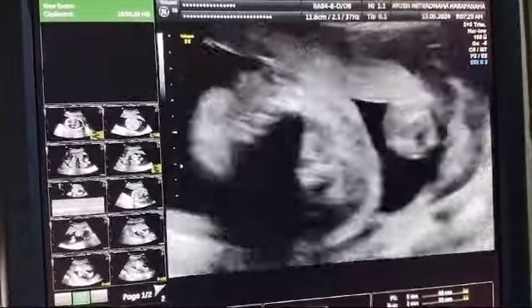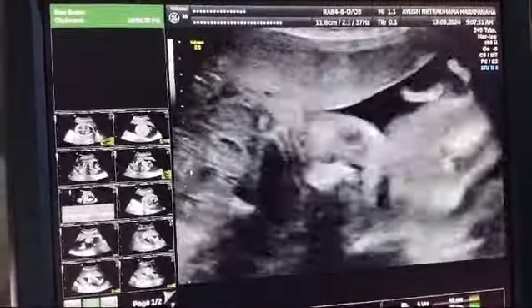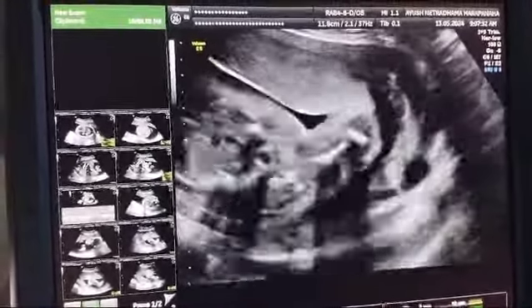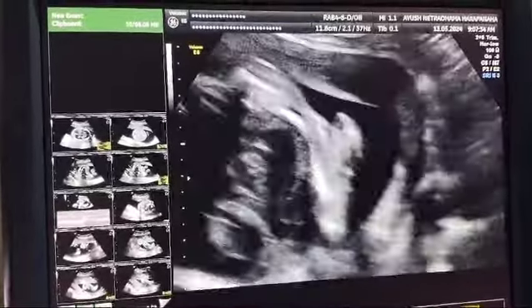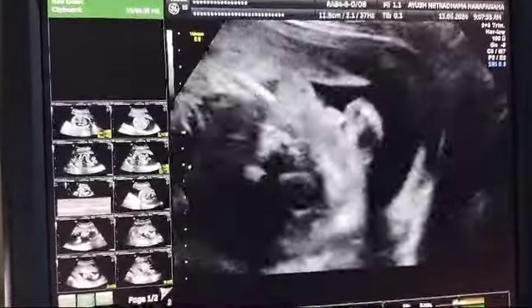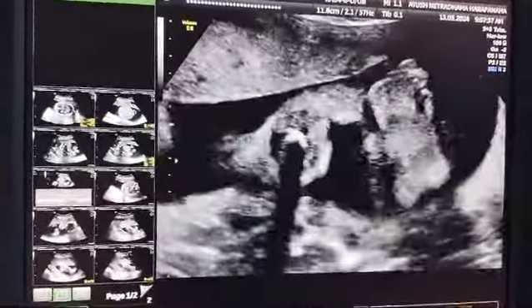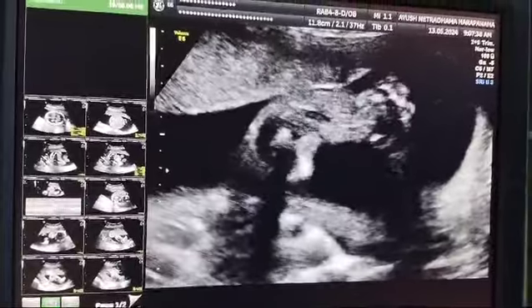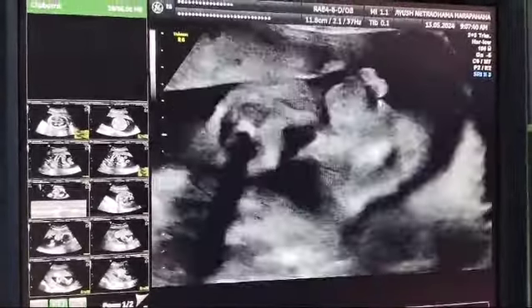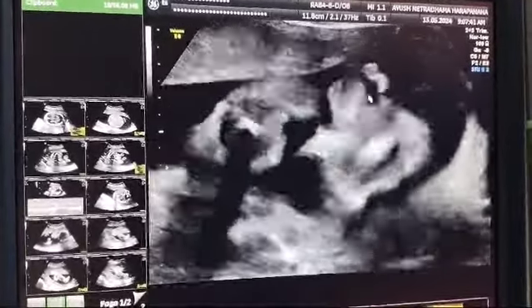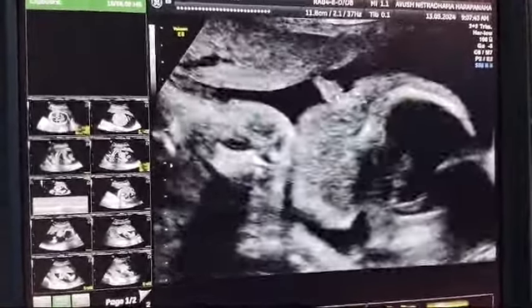Looking at the other upper limb as well, the humerus is short and the fingers are stubby. You can see the hand here. The ear is also visible at this level.